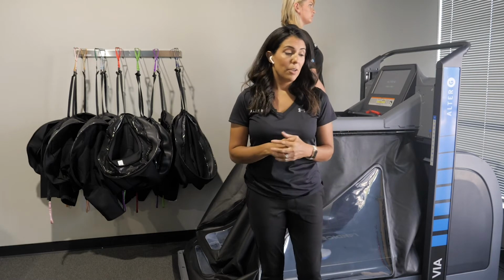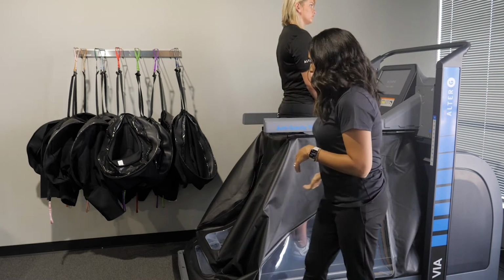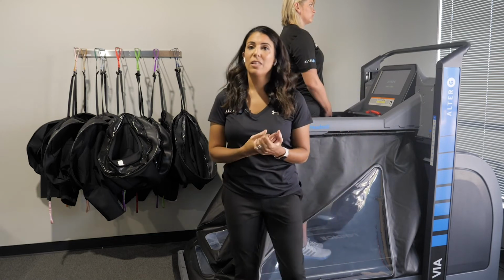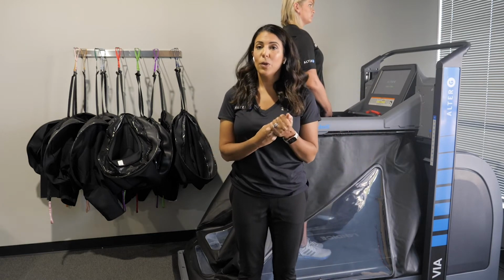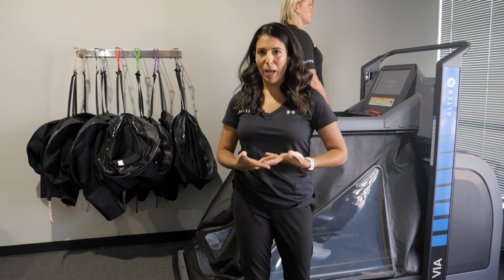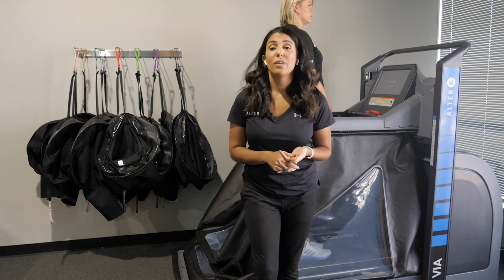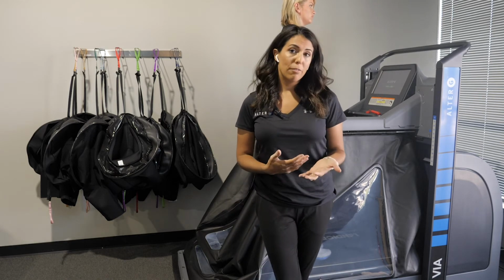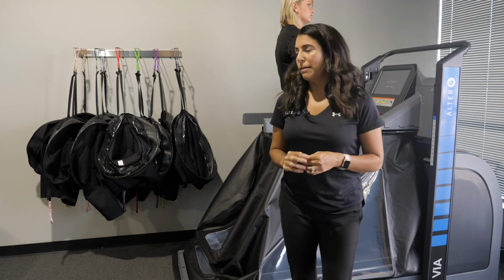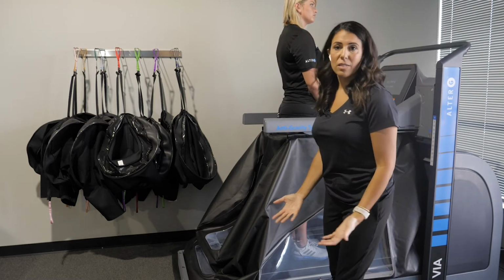So there's not one time that you're going to get on the machine and not have it calibrated specifically to the user weight. The load cells underneath the treadmill are going to, again, calibrate specifically the user's weight first, so that when we know that we're removing 20% of that patient's body weight, we're actually removing 20% of your body weight. We're not making an assumption, and it's not a range. And that's really important when we talk about individuals who are recovering from surgery or injury, where we really need that specificity of unweighting.